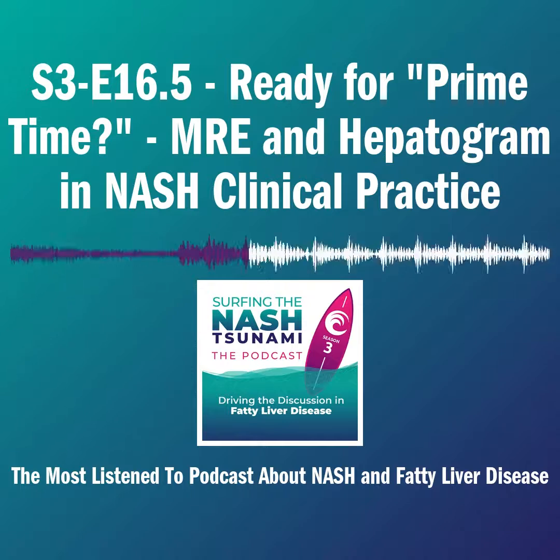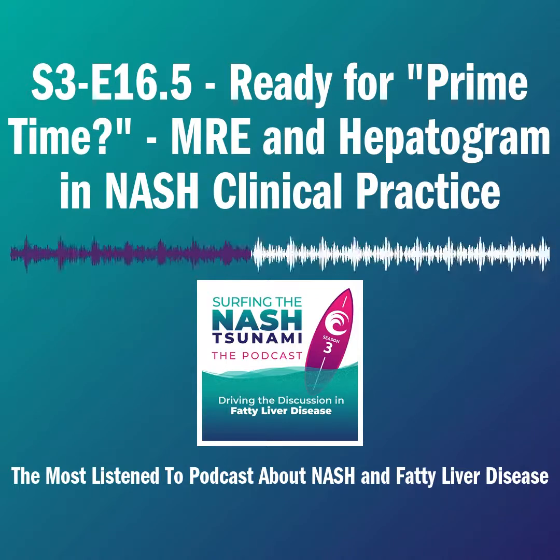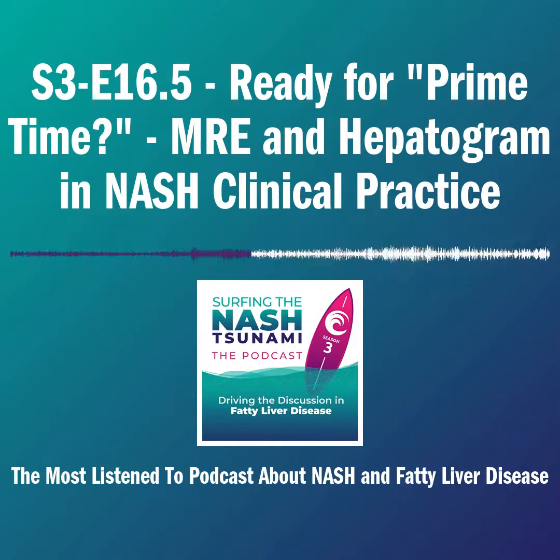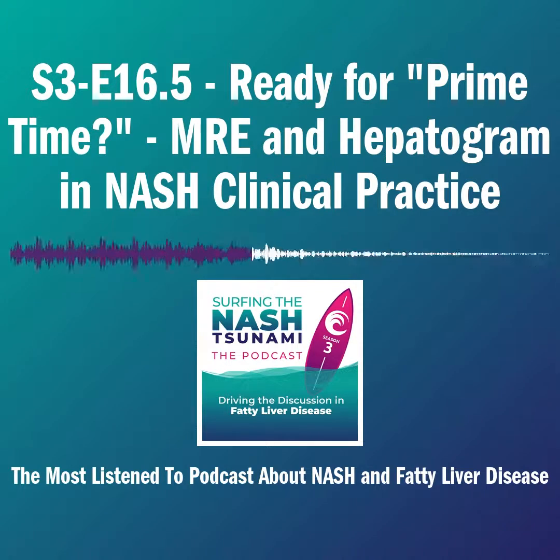But on the research side, I want to highlight a few things. It's been a really great year for MRE. It's exciting to hear about Mazen's work on MAST, as well as MEFIB from UCSD, and both combining Mazen and Alina Allen's work demonstrating liver stiffness can predict clinical outcomes, both in cirrhotic and non-cirrhotic NASH. These are really important papers that will help accumulate the evidence needed for regulators to accept these imaging tests as trial endpoints. We hear they're already used in clinical practice.